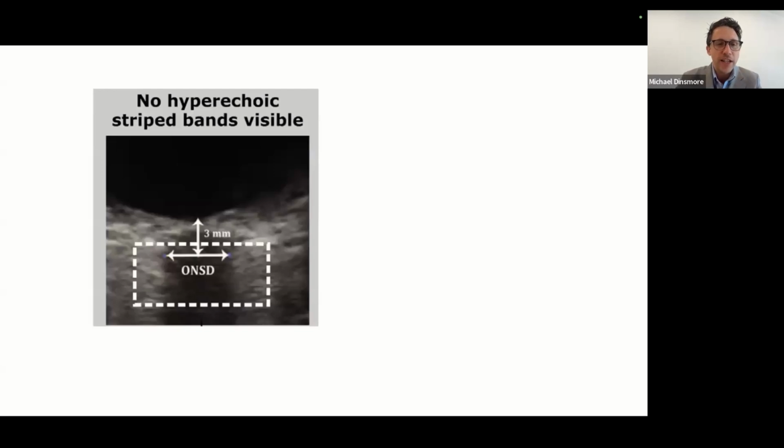So initially, if we looked at, again, over the last decade with older ultrasound machines, this is often what we'd see. Just one straight line back. As long as they're perpendicular, you have a fairly good image. You measure 3 millimeters behind again, and then you're measuring this optic nerve sheath diameter across. So it was easy to pick your sides because it was just the line between the hyperechoic and hypoechoic. But again, we weren't really certain where we were on the sheath. So you can imagine if you're scanning and catching just the edge side, it might be underestimated, and we're not sure exactly in the middle. It was difficult to convince yourself of an absolutely perfect image.